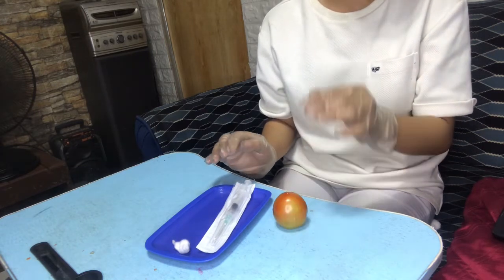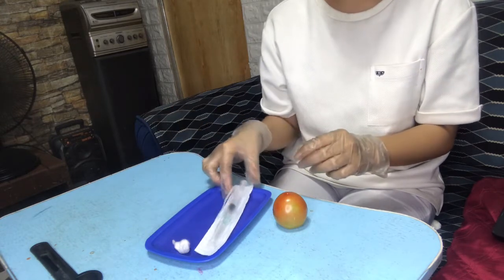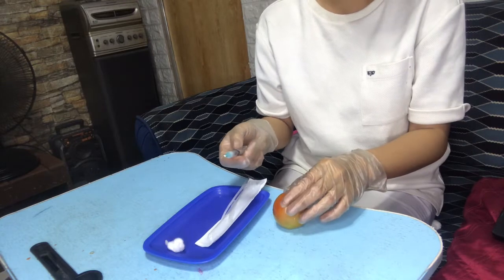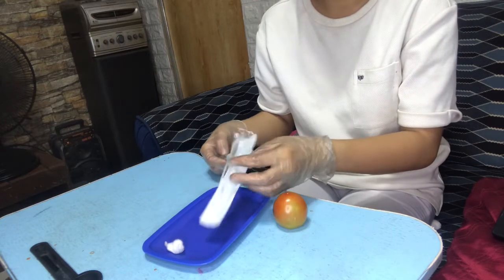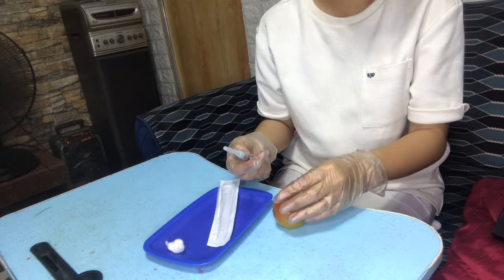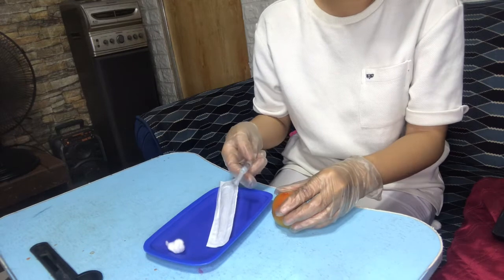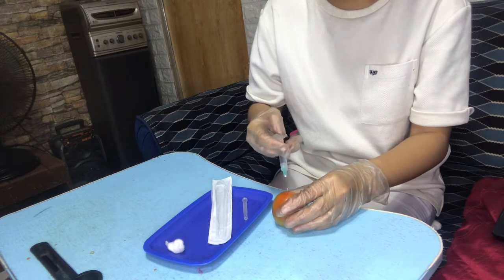First, grasp the syringe in your dominant hand by holding it between your thumb and finger, with palm facing to the side or upward for a 45-degree angle insertion. Using the non-dominant hand, pinch or spread the skin at the site and insert the needle using the dominant hand with a firm, steady motion, at 45 degrees.